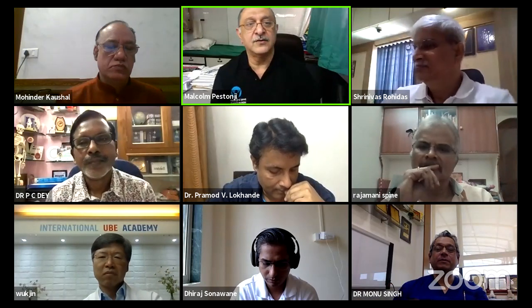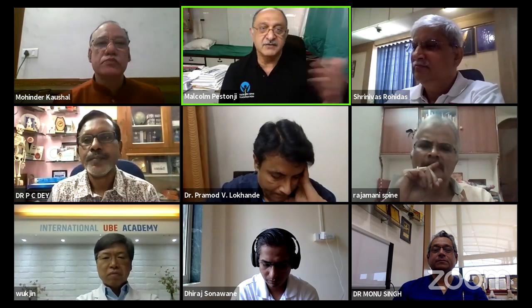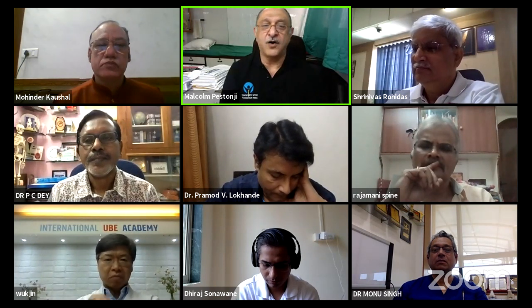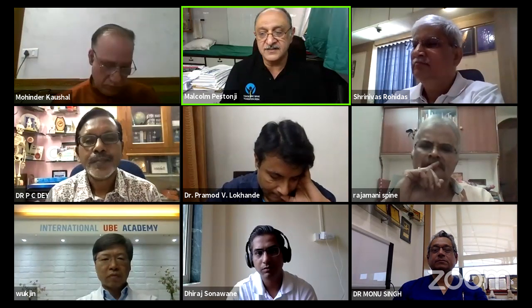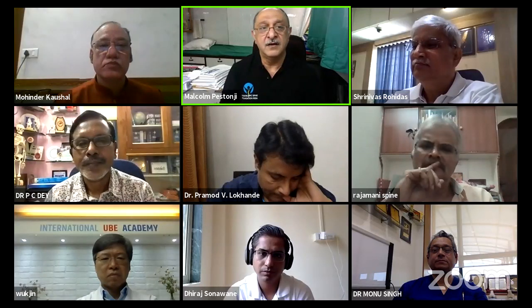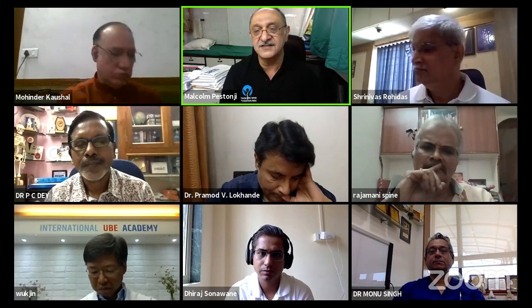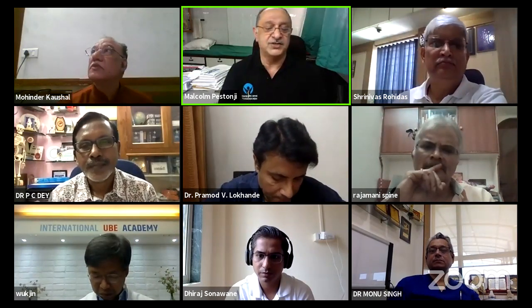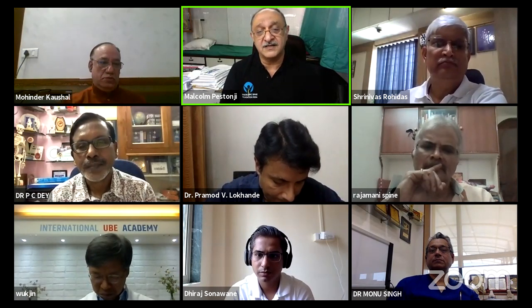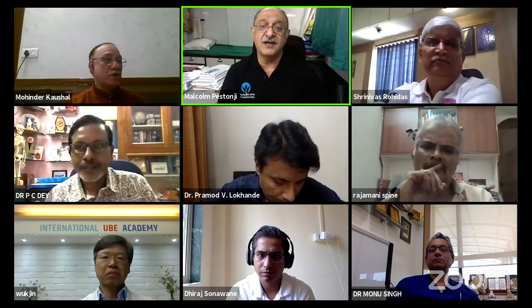Monu sir, I will answer you this way. In my own personal learning curve, I started with microendoscopic discectomy, which most of all of us have started with. Then I started with the Destandu system. And subsequently, I learned transforaminal, but I found transforaminal falling short in many areas, causing a lot of root dysesthesias, sometimes root paralysis. So I felt okay, I needed a better option. So I initially picked up Dr. Lim's technique of PSLD. Now in PSLD, we are using a thicker scope, akin to what Dr.